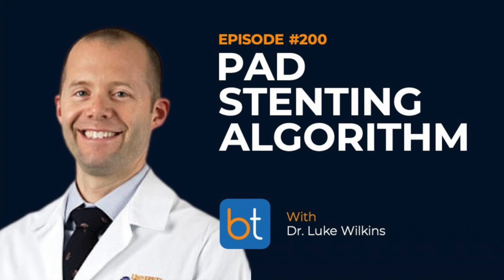But it is really beneficial, if you're looking at tackling these CTOs, to be familiar with some of the Safari techniques so that when you find yourself stuck in those situations, you have a couple tools to throw at it. Safari is one of my favorite things to do as a young attending because sometimes you just look at the cap morphology and you're like, oh, that's totally crossable from the below. And then I feel like, at least for me, after having done a couple cases, I'm more likely to call it quits on the antegrade approach earlier on and just be comfortable with going from the below. Have you felt the same way?